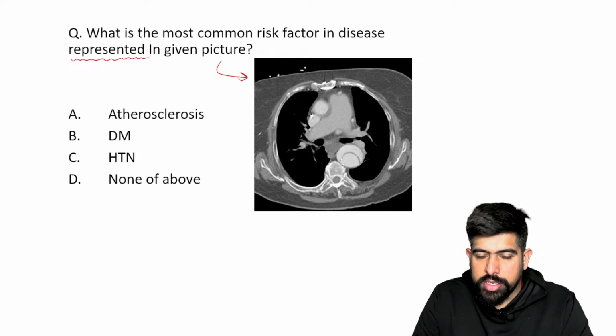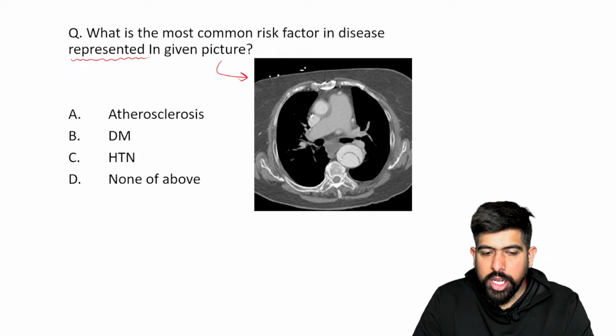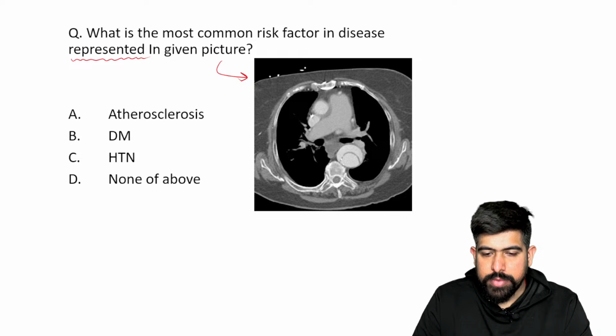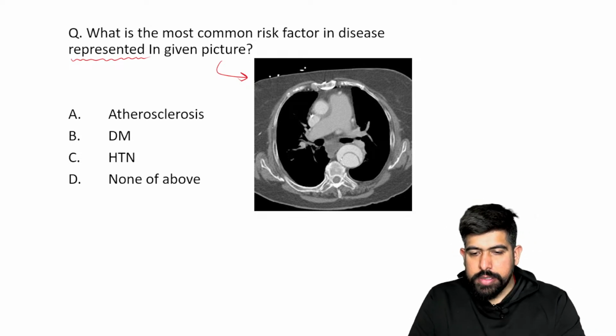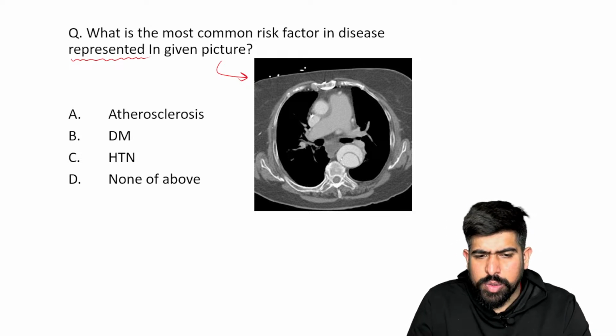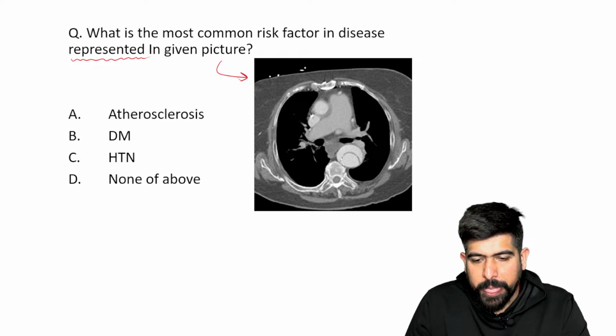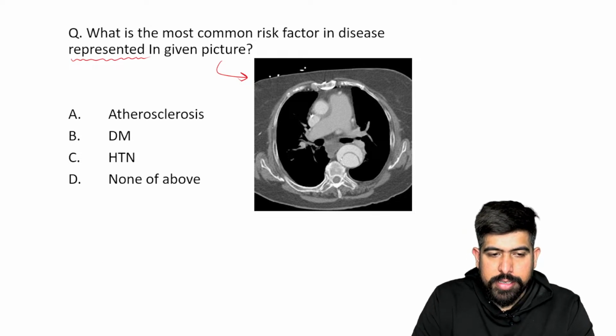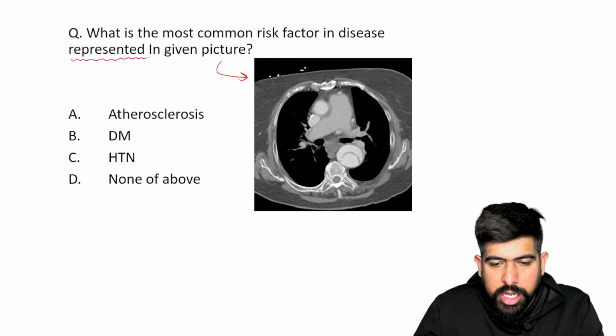First of all, yes, this is a CT. CT of thorax. Yes, chest CT. Agree with you. Now tell me what is seen in this condition. Some issues with the ventricles? I don't think so. Just try to look at the CT scan again.